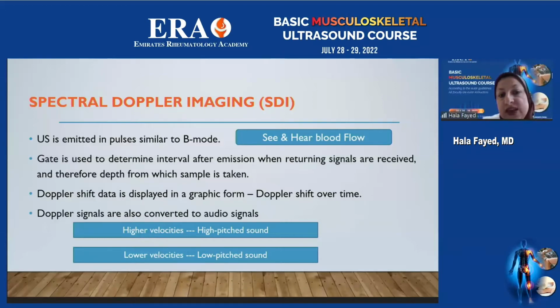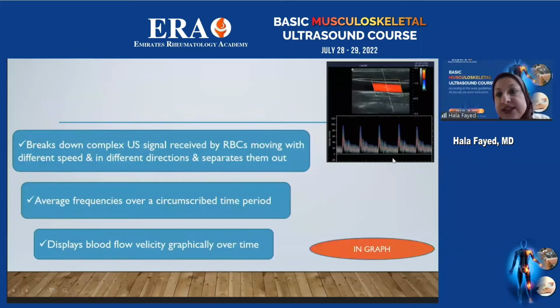In this case, higher velocities will give a high-pitched sound, and lower velocities will give a low-pitched sound. Here is the spectral Doppler imaging.